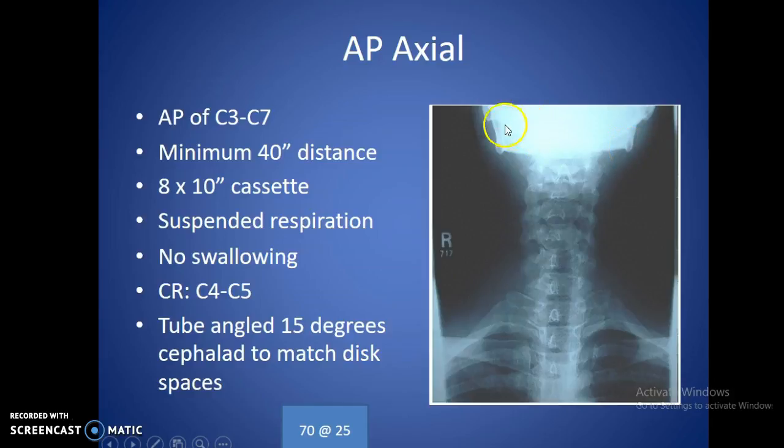Okay? If the skull looks pretty round, which you can see a very faint roundness going across here, this is the occipital bone, or the back portion of the skull. If that is going over the vertebra, then your head is too high and you need to bring the chin down just a little bit.